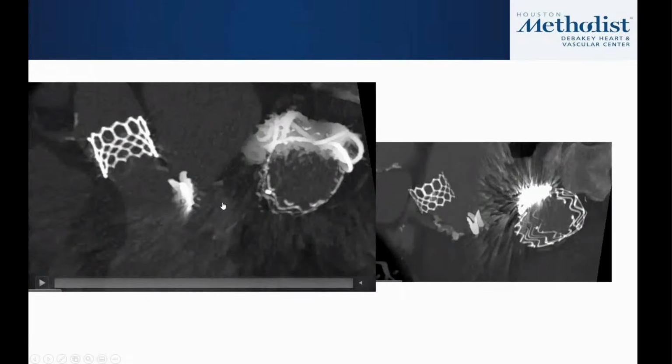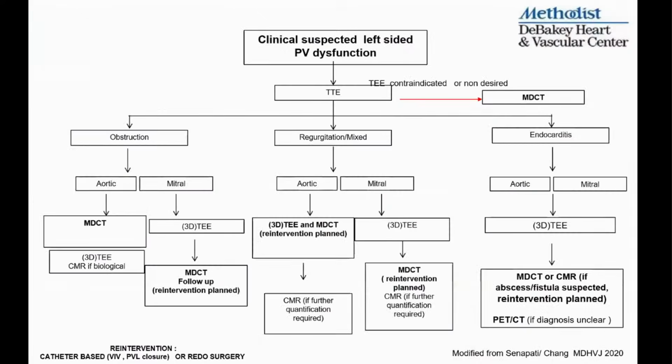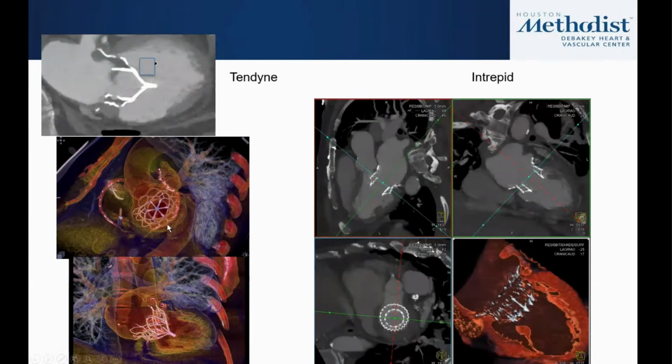But more and more we'll be seeing cases like this, patients with TAVR with mitral clips. So this is kind of what we'll be looking at right now if you're interested in doing cardiac CT. Okay, and this is the new transcatheter mitral valve that we'll be working.